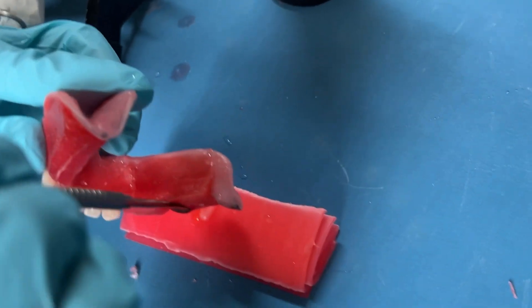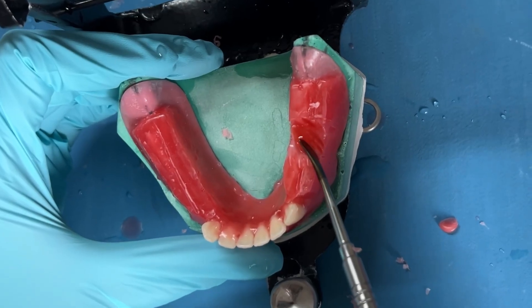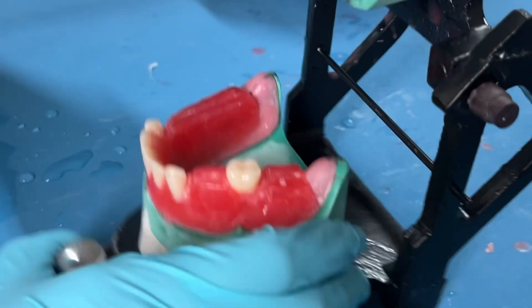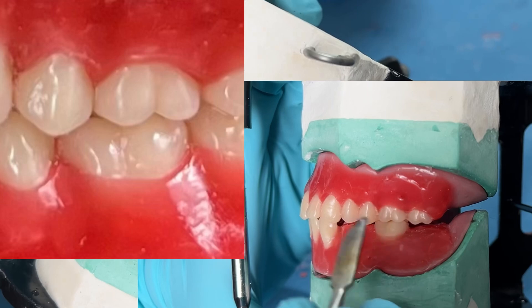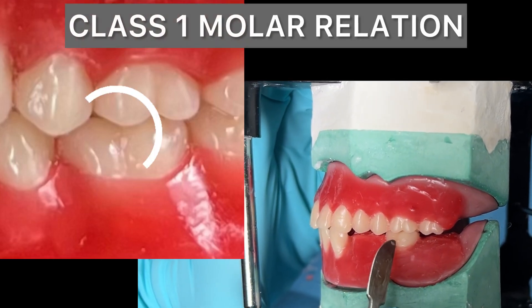Soften a wax spatula and remove the wax between these two lines. Make a soft pool of wax and arrange the mandibular first molar in such a way that the mesio-buccal cusp of the maxillary first molar coincides with the buccal groove on the mandibular first molar. Here you can see that the mesio-buccal cusp of the maxillary molar coincides with the buccal groove of the mandibular molar.